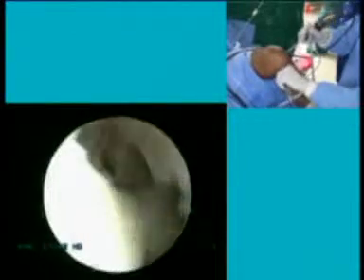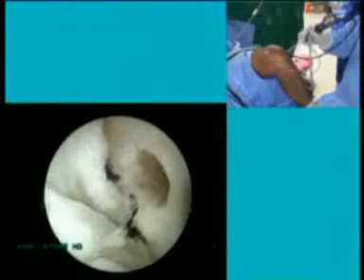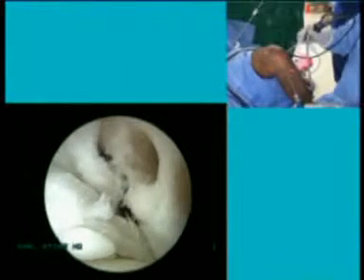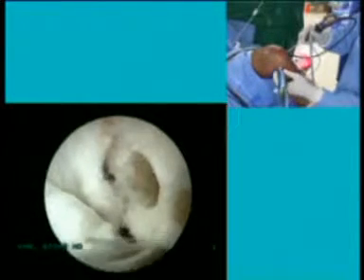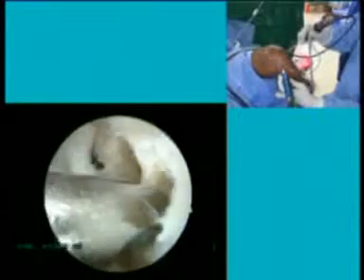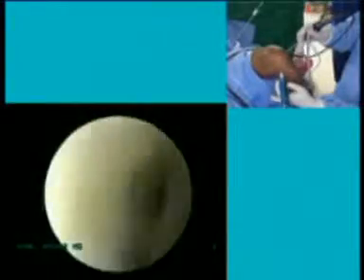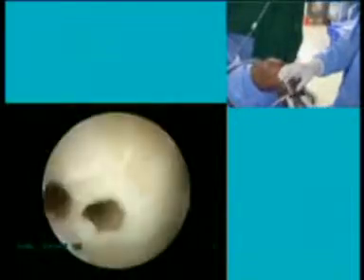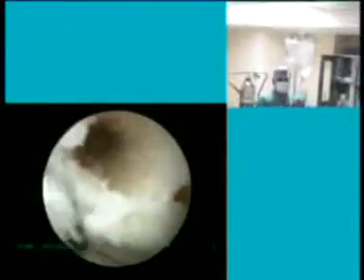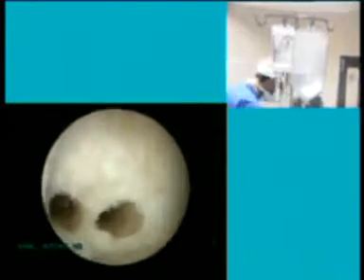Can I ask you, are you using a pump or any form of pump? No, I use no pump. We use only gravity. Okay, now I'm finished with my femoral tunnels. Do you have any questions about femoral tunnel preparation?